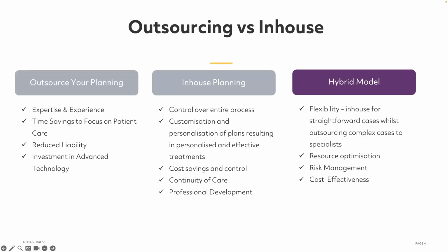So in choosing between outsourcing and doing it yourself for clear aligners, it depends on the complexity of each case and the resources available to you. By integrating both of these approaches into a hybrid model, we can deliver optimal care and ensure the best outcomes for your patients and your customers.